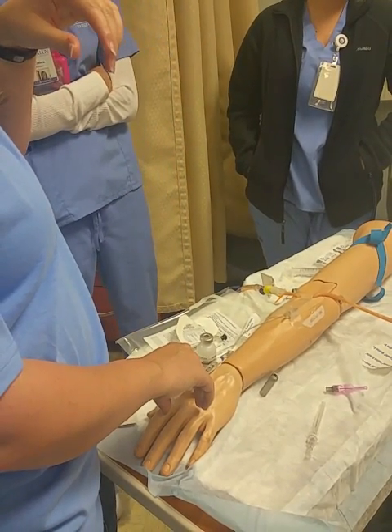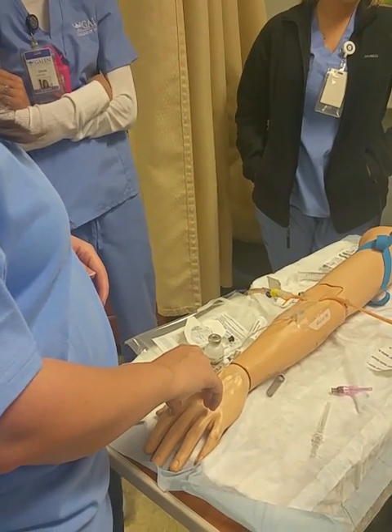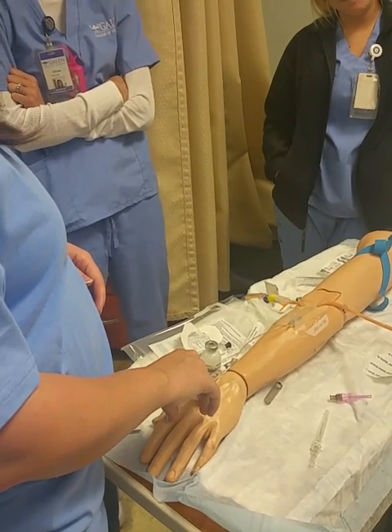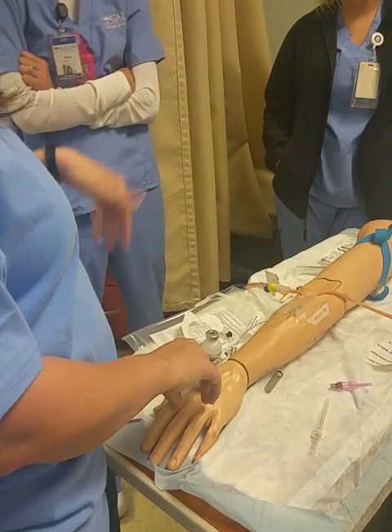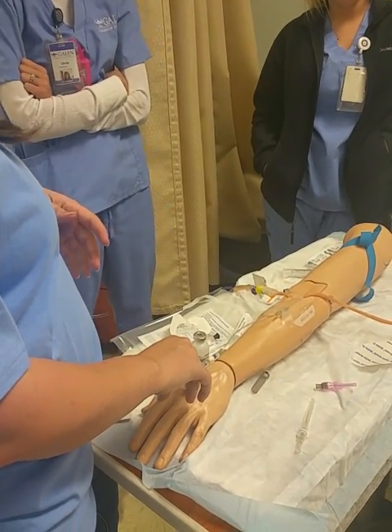Wait, do we write this down on paper, like the order? Yeah, your order will be on paper. So I can do the math, because you keep saying numbers and I forget what the number was before. Yeah, yours will be on paper. So I'm going to push 1/4 of an ml every 15 seconds. Usually after about the first 30 seconds, I tell you just to push the rest of it.